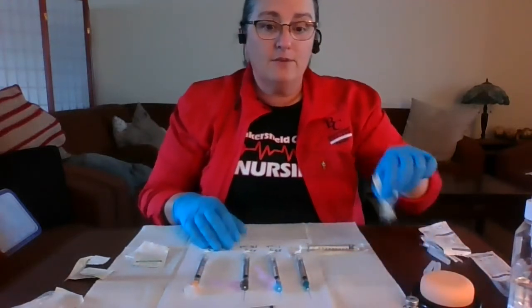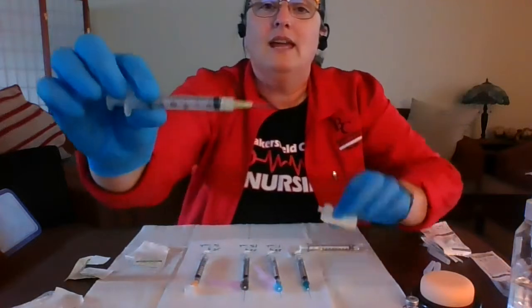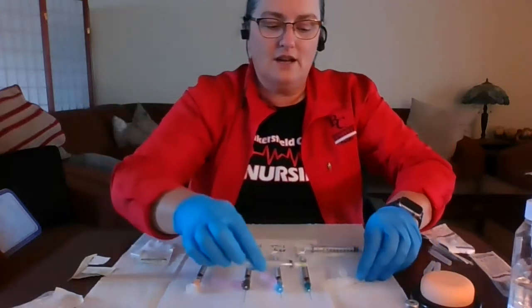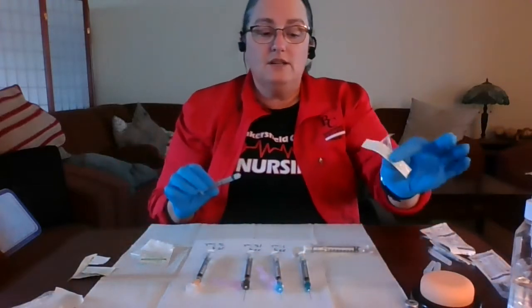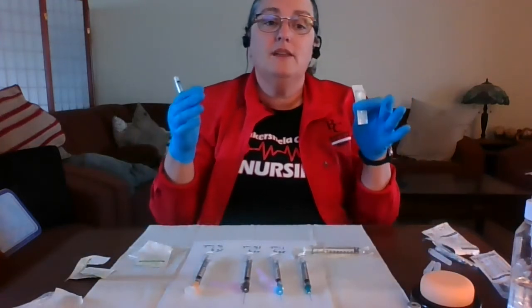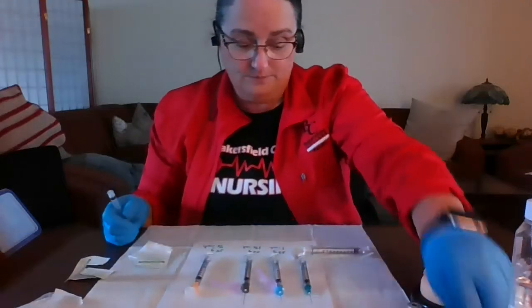And you might have just a larger gauge needle that you're using as a draw needle. This is a 20 gauge needle. And this is also something that I've seen in order to be able to draw up. Again, using the scoop method, if it does not have a safety on it, you would insert, remove, and have some sort of needle safety. If you don't have an actual needle safety repository, some sort of sharps container, then you would want to have a container that's specifically for that use, that is entry only and not exit, so the needles can't come back out.